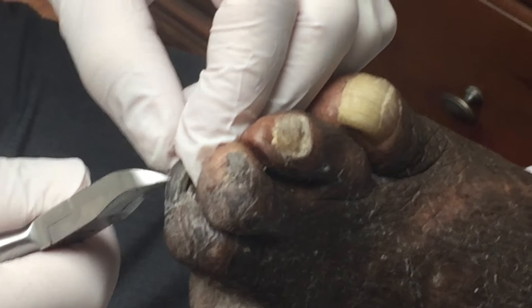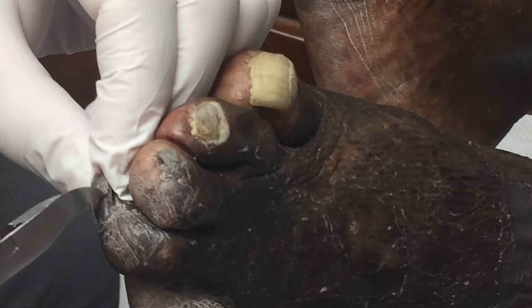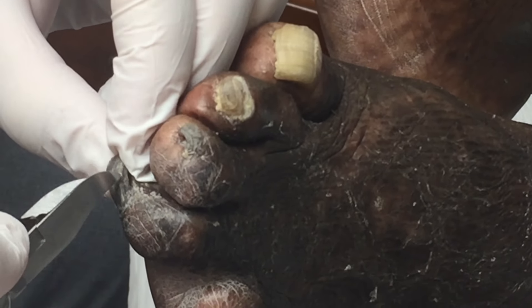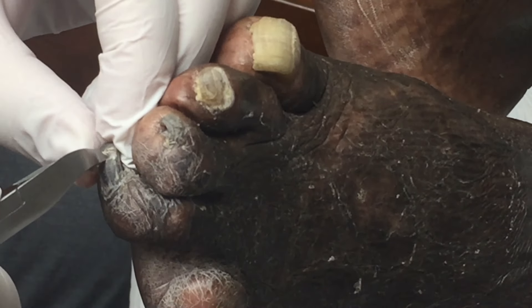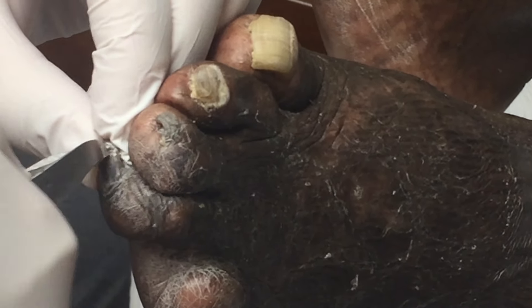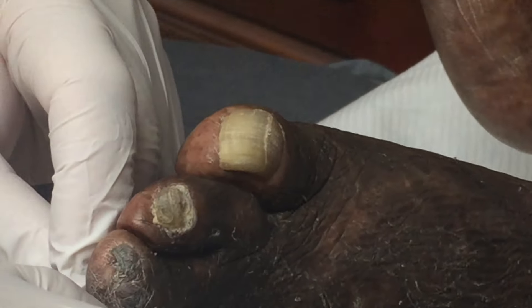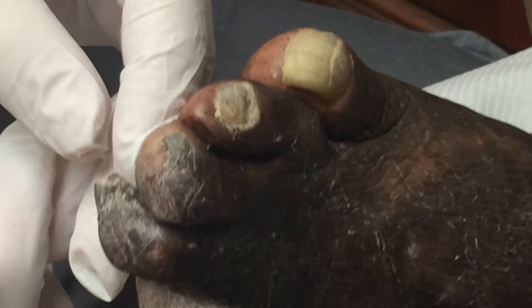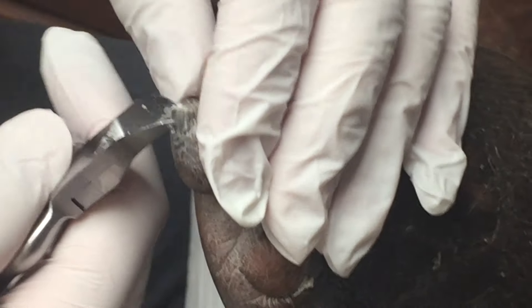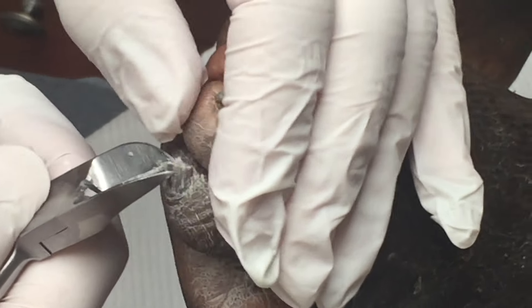Let me know if I'm hurting you, alright? Like I normally do, I work from right to left. Just want to remind all the diabetics out there how important it is to come in on a routine basis to get your feet looked at.